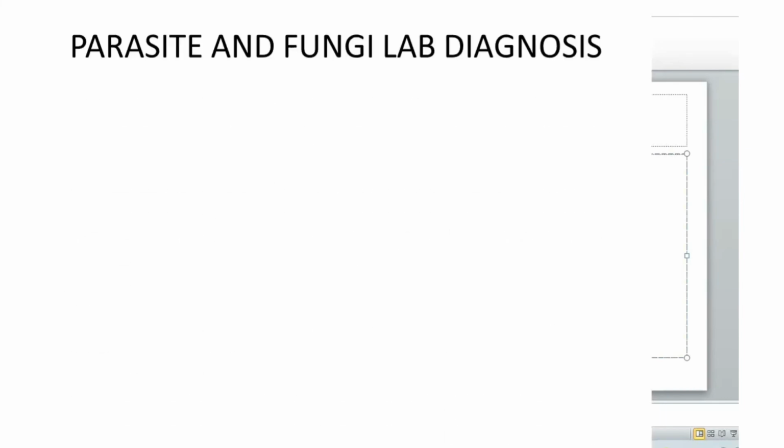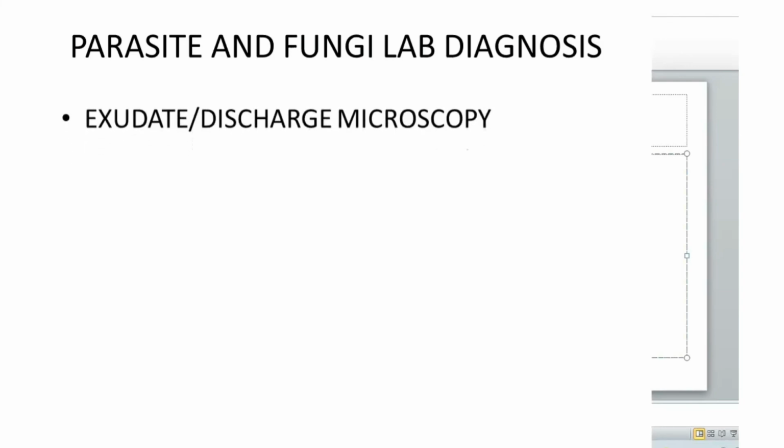For parasite and fungal lab diagnosis, usually we use the microscope, and you look at the exudate or the discharge, looking for the parasite or the ova of the parasite. Sabouraud agar is used to culture fungi, and that should help in identifying the fungi causing the lung problem.